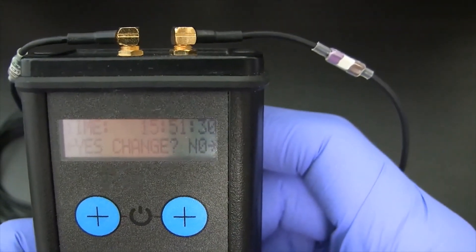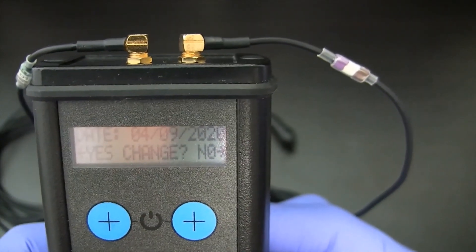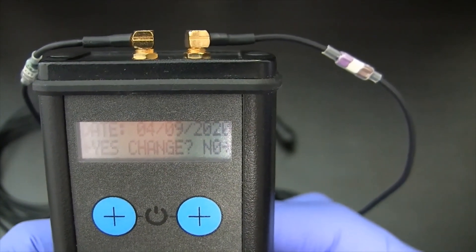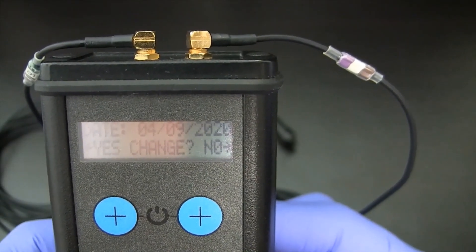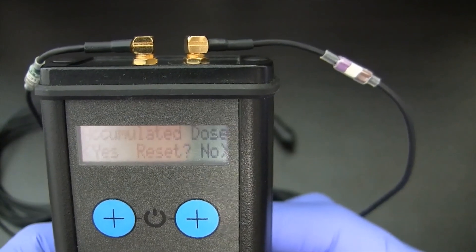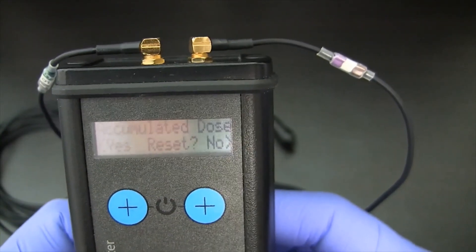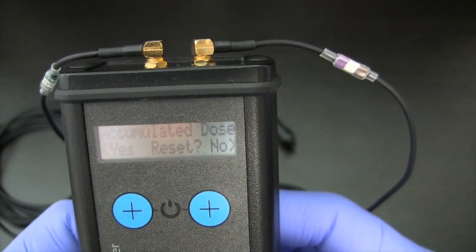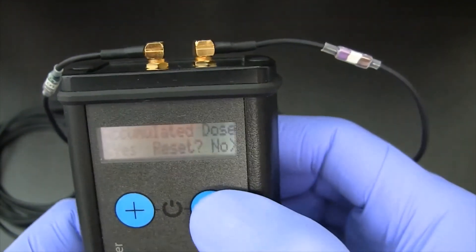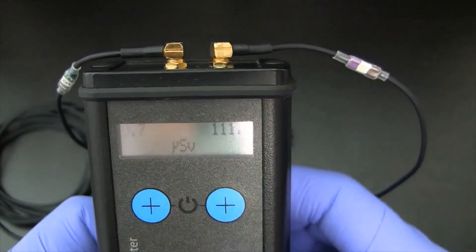This allows you to make a change if you want to the date and time. If you don't want the user to have to be bothered with this each time, you can disable it through the software that's run on the PC through the USB interface to make changes to the parameters. So in this case, it's timed out, it's past the date and time, and now it's asking me if I want to reset the accumulated dose. And I'm going to say no in this case. So by pressing this button, I'm selecting no. There again, it timed out.